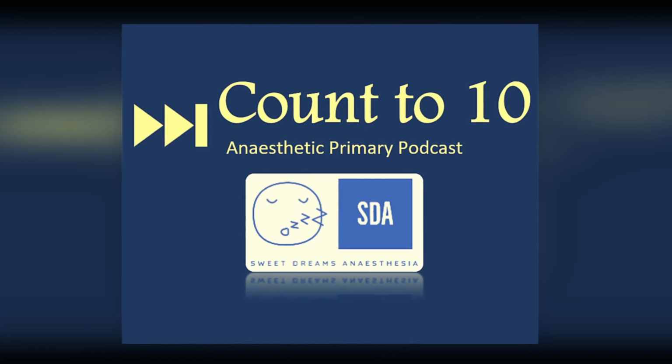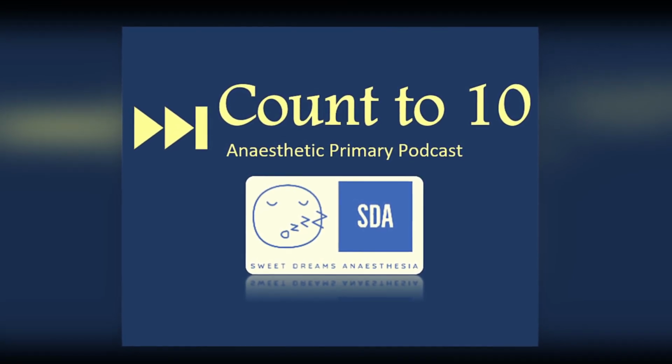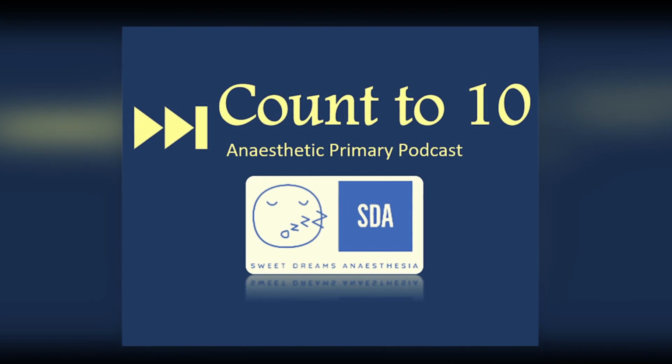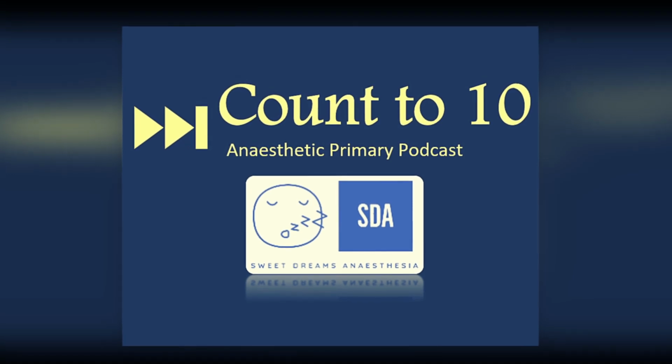And really, you don't want to miss the big ticket items like the intrinsic errors in accuracy with the readings themselves. The biggest risk for an error with a SATS probe is typically movement or malposition. And the biggest error from the patient perspective is typically a low output state, leading to poor perfusion.